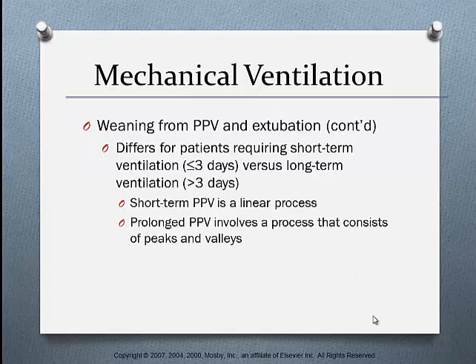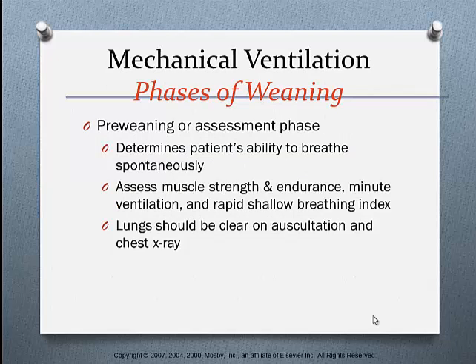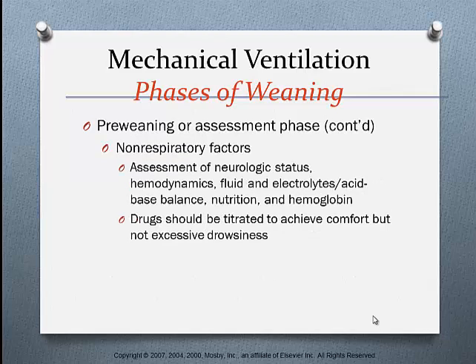Some will require just short-term ventilation versus long-term. The pre-weaning assessment again determines the patient's ability to breathe spontaneously, and assesses muscle strength and endurance, minute ventilation, and rapid shallow breathing index. The lungs should be clear on auscultation and on chest x-ray.